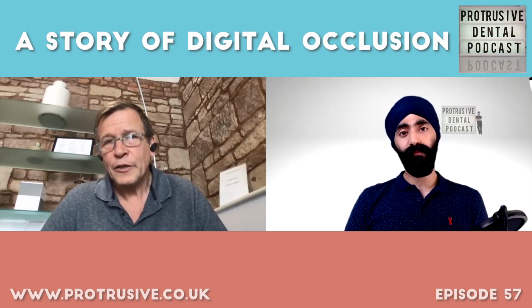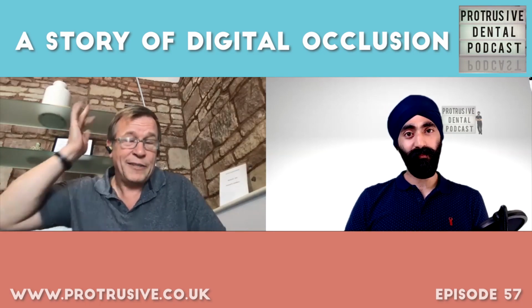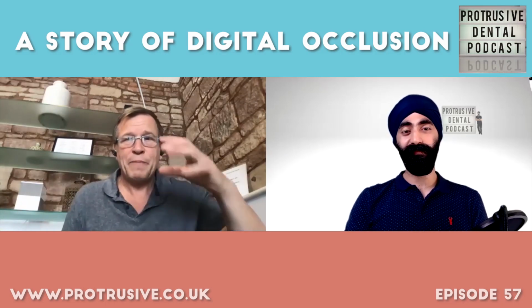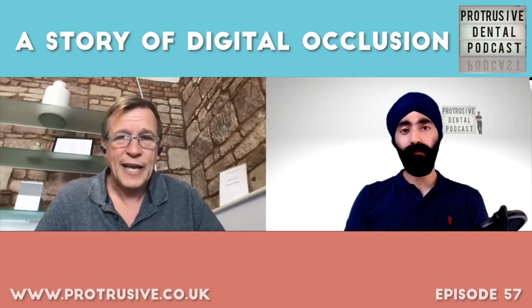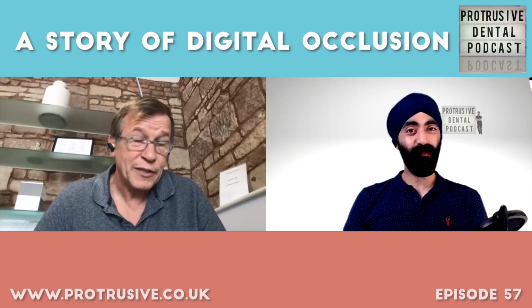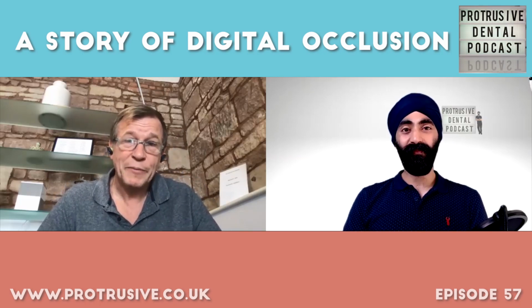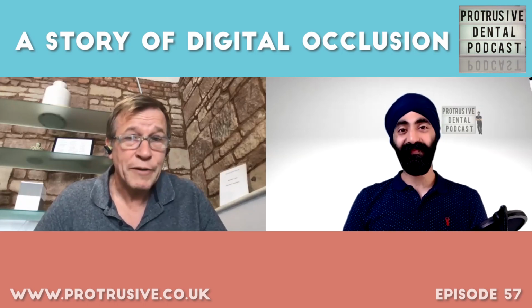Certainly back to Pete's day and people since then, it's like, oh, well, we take all these models and then we mount them up and then we spend 4 hours doing our wax up and then we show that to the patients and they're bound to say yes. And we all said, oh, that's fabulous. And actually, most people are prepared to go along with it because they never do it. And those of us that did do it were so invested in it that we didn't want to say that we weren't that good at it. So it didn't always work out great.